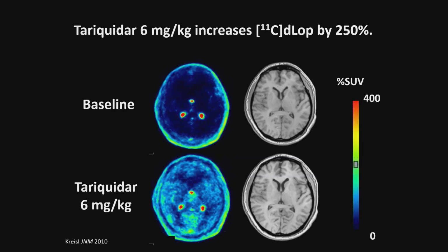Okay, well, can we increase the uptake of a drug with a PGP inhibitor in human subjects? And we can. So you can see this is the baseline uptake, no uptake in the brain, but there's uptake in the choroid plexus. And if we give this inhibitor at 6 milligrams per kilogram, we can increase the delivery of the drug to the brain.